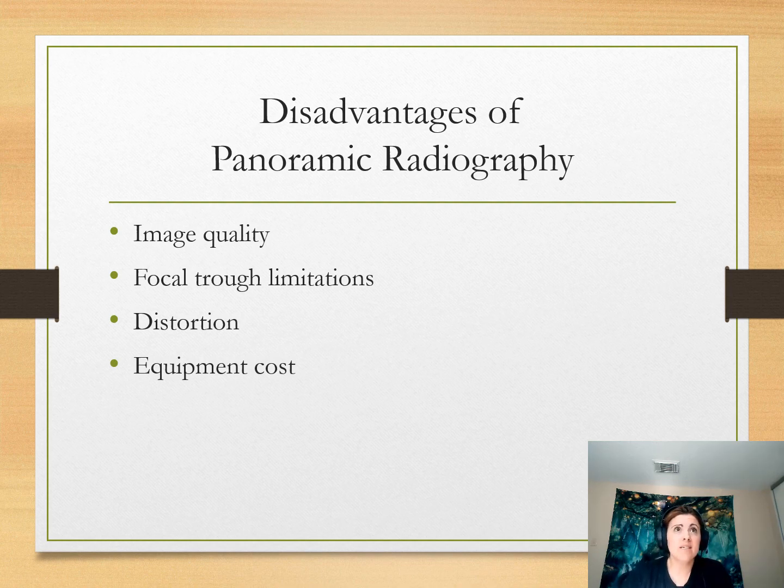So keep in mind, panoramics are not as sharp as intraoral radiographs. The structures have to be inside the focal trough in order for them to not have that distortion. And I already said the panoramic is more expensive. So it's not perfect, but it is certainly a wonderful adjunctive aid to taking our radiographs.